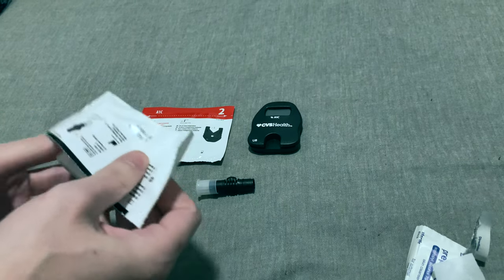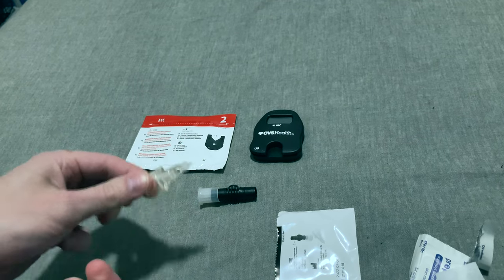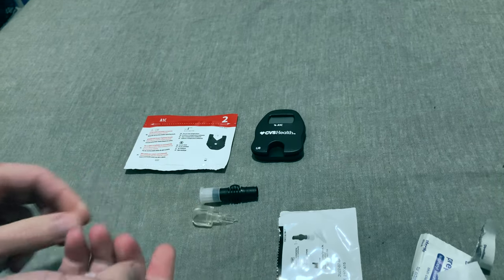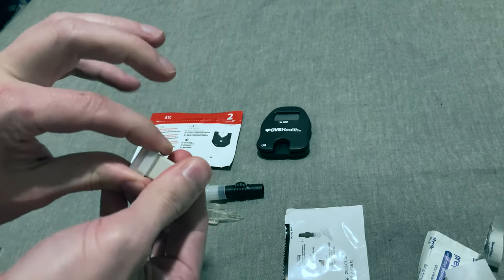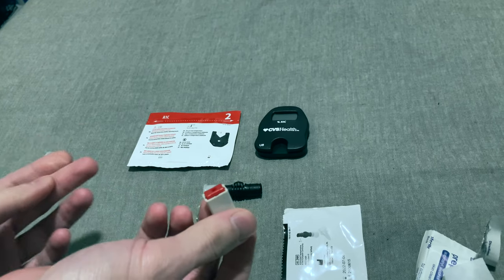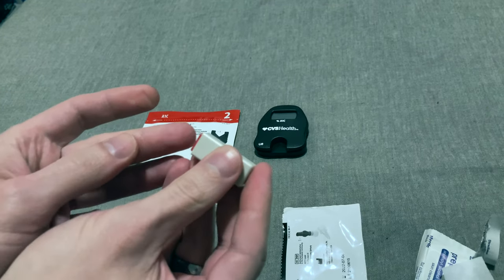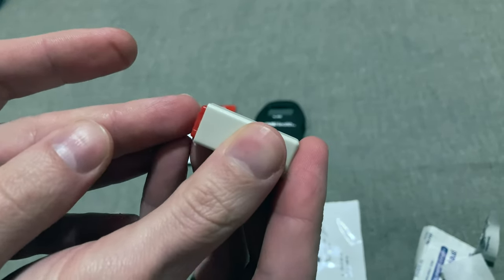And the blood extractor. Sample collector. Or sample collector. And the lance that has a cover that you have to pop off. All right. Now, once you pop the cover off the lance, you're going to press this into your finger. Make sure you get it deep enough. Like that.